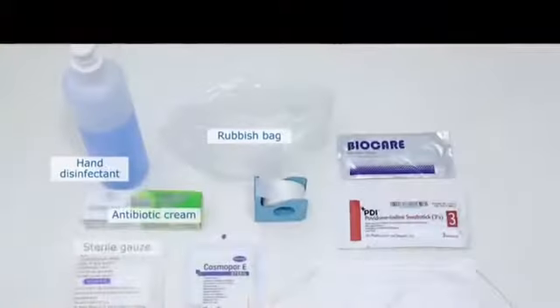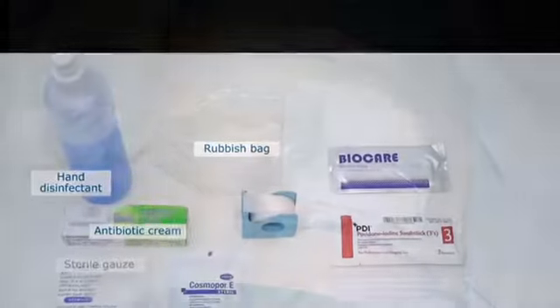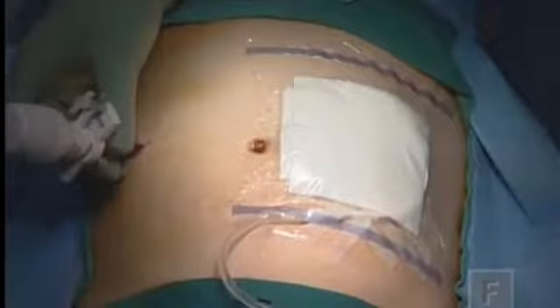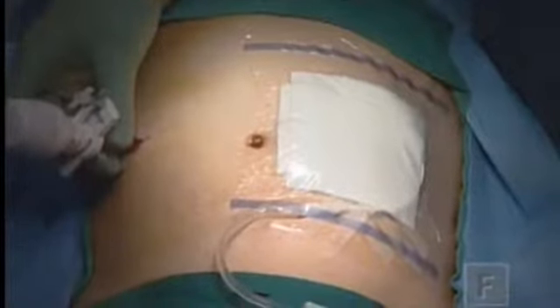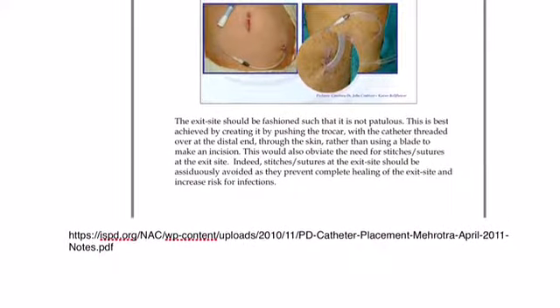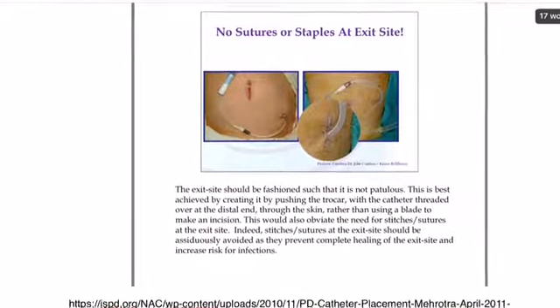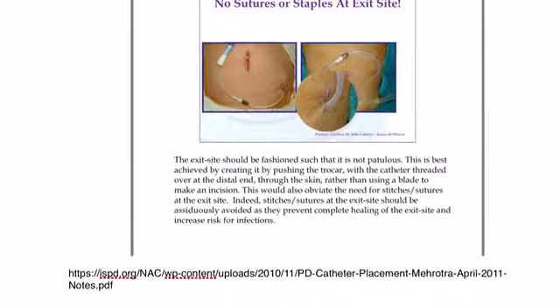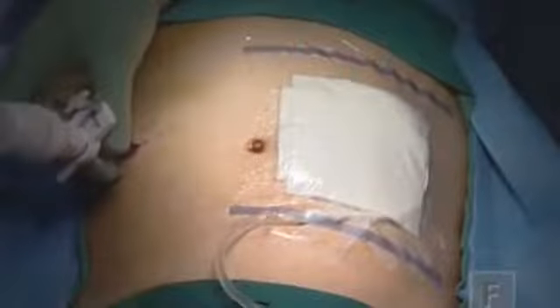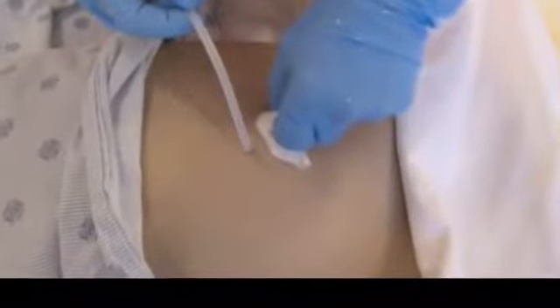So in the long-term care of the exit site, your goals are to prevent exit site infection and to identify problems promptly. Routine exit site care is recommended daily or 3 to 4 times weekly, or whenever the exit becomes wet or dirty. Exit care may be done in conjunction with shower or bathing. Showering is preferred; if bathing, the exit site should not be submerged in bath water.